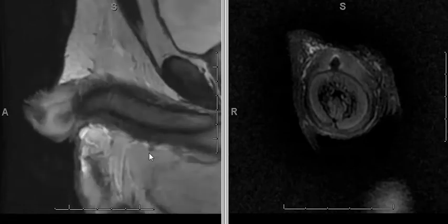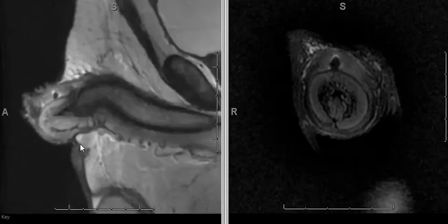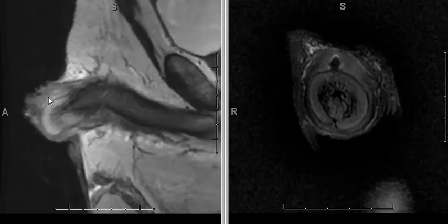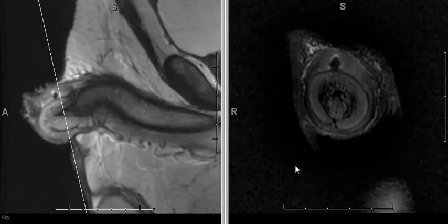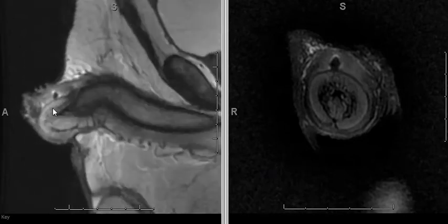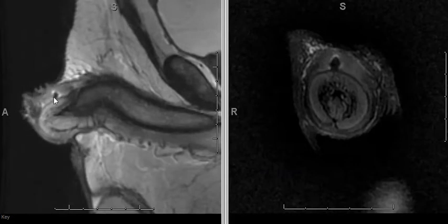This is a case of a patient who presented with a growth in the foreskin of the penis, which was biopsy-proven to be squamous cell carcinoma. On the sagittal T2 sequences, you can see the thickening of the foreskin, which was the biopsy-proven carcinoma. You can see some post-biopsy changes here.